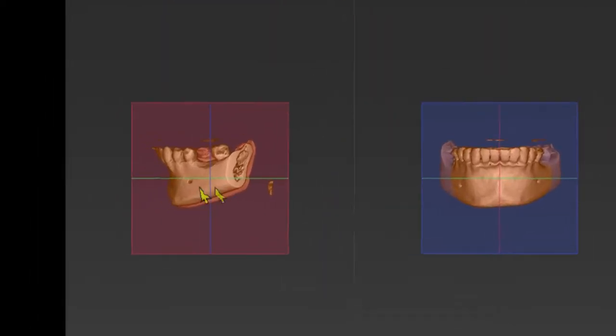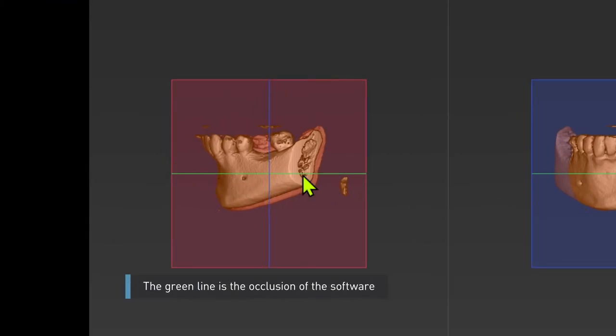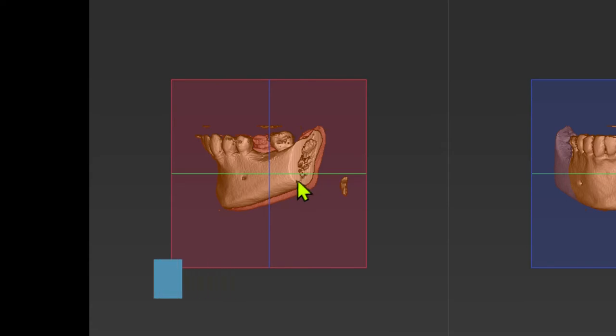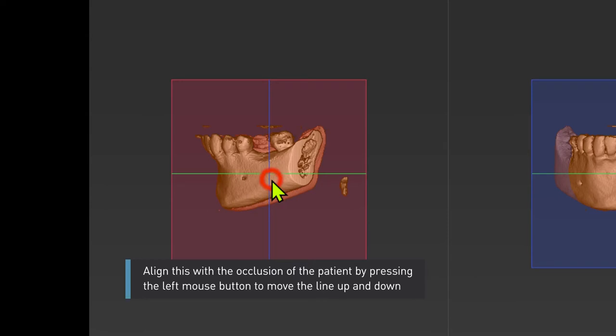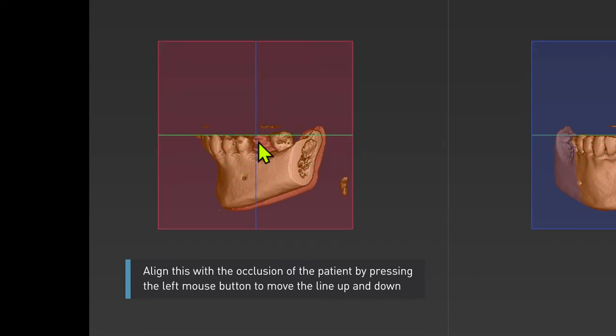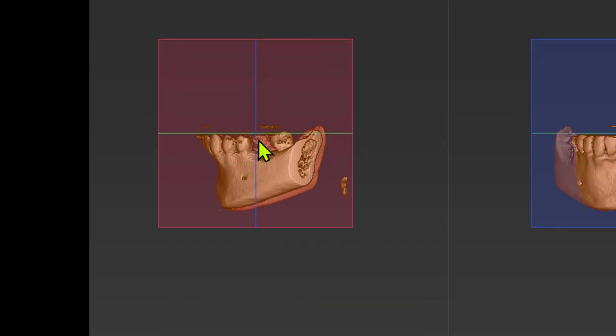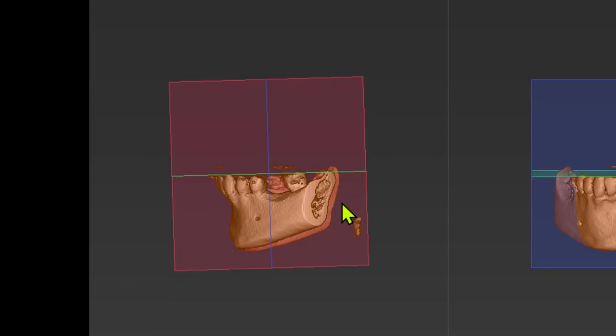The green line is the occlusion of the software. Align this with the occlusion of the patient by pressing the left mouse button to move the line up and down. With the right mouse button you can rotate it.